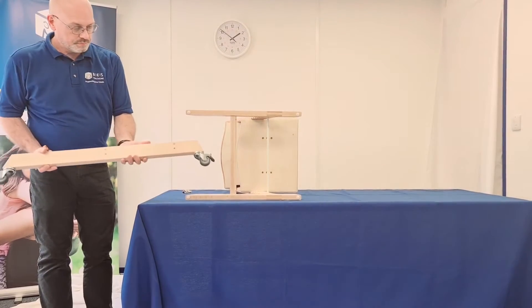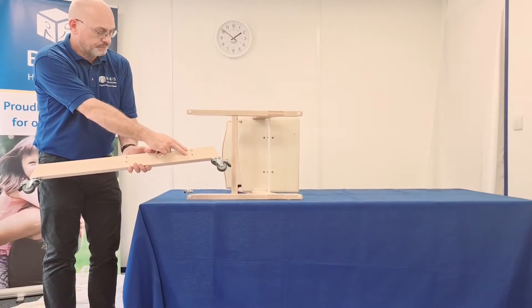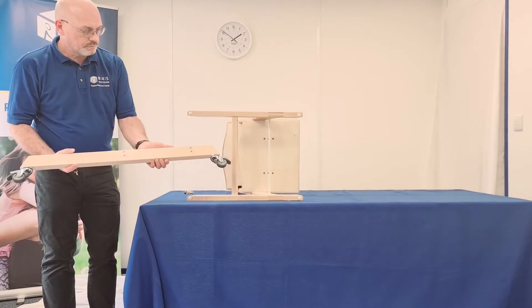Skis are available with and without casters. Here, the skis are with casters. The skis without casters are for added stability.